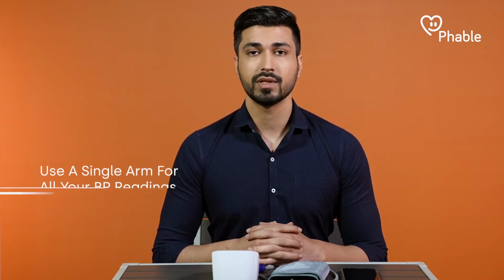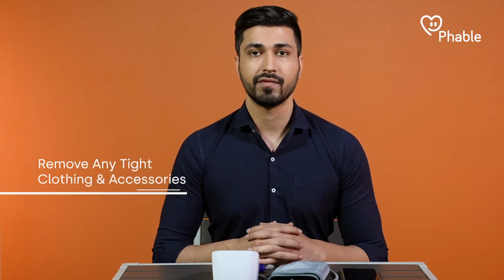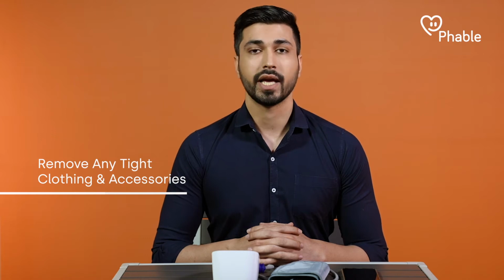BP values can differ between your right and left arm. Omron recommends that you use the same arm for all your measurements. You should also remove any tight fitting, thick clothing, or any accessories from your upper arm before you take your measurement.